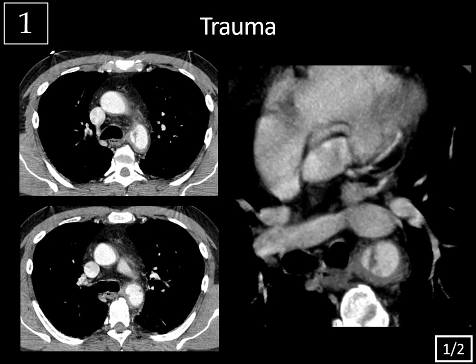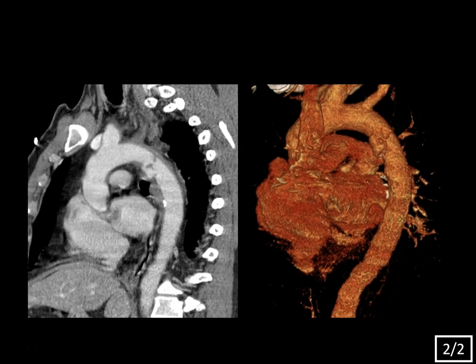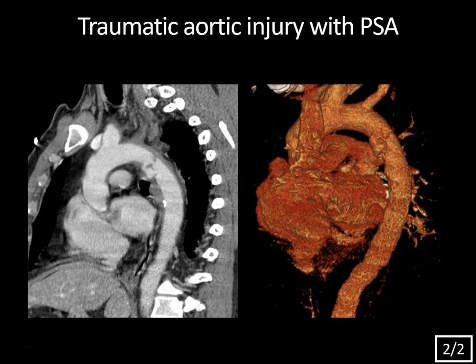So I gave you a vague but helpful history of trauma, and these images show an intimal flap extending transversely across the aortic lumen here, focally, and there's also a small intramural hematoma at the posterior aortic wall here, as well as a small mediastinal hematoma. Notice how there's a bulbous contour to the anterior aspect of the aorta, which makes you concerned there could be a pseudoaneurysm or a contained rupture. The sagittal images show that much more nicely — indeed, there is a pseudoaneurysm here at the site of this intimal flap, and you can also see that on the volume rendered reformatted images, the pseudoaneurysm outpouching here. This is typical for a traumatic aortic injury with pseudoaneurysm development.